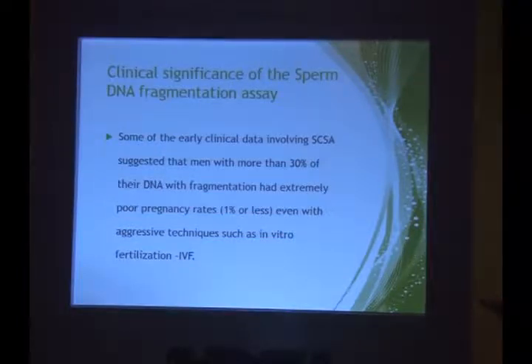I think we have come to the end of this topic. And how much time do we have? We have some time. I would ask Ekta to show the remainder of the density gradient separation, and after that, for the last topic, I will ask Dr. Ajay to speak briefly about sperm function assays, because that's the closing gap we want to close, as to what options are available to patients. If semen doesn't tell you the complete story, what else can be added? And then we will keep some time for question and answer, and I hope that will address most of your issues.